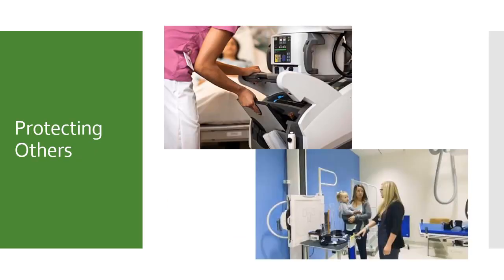The last topic I want to talk about in this video involves bystanders and family members. It is the job of the technologist to ensure the area is safe prior to taking exposures. This requires notification during mobile exams of all personnel and family in the area of the X-ray equipment. It also means not having family or other technologists in the room when performing exams if possible.